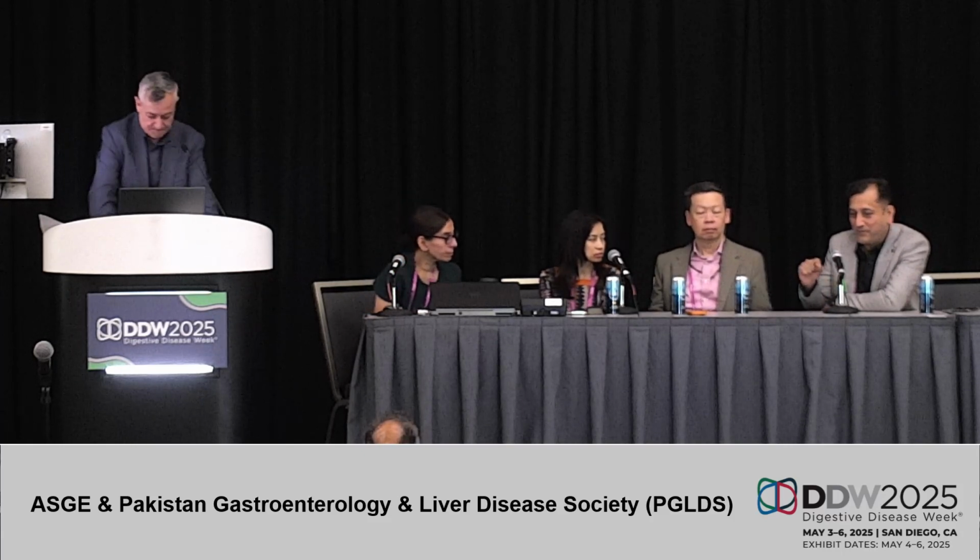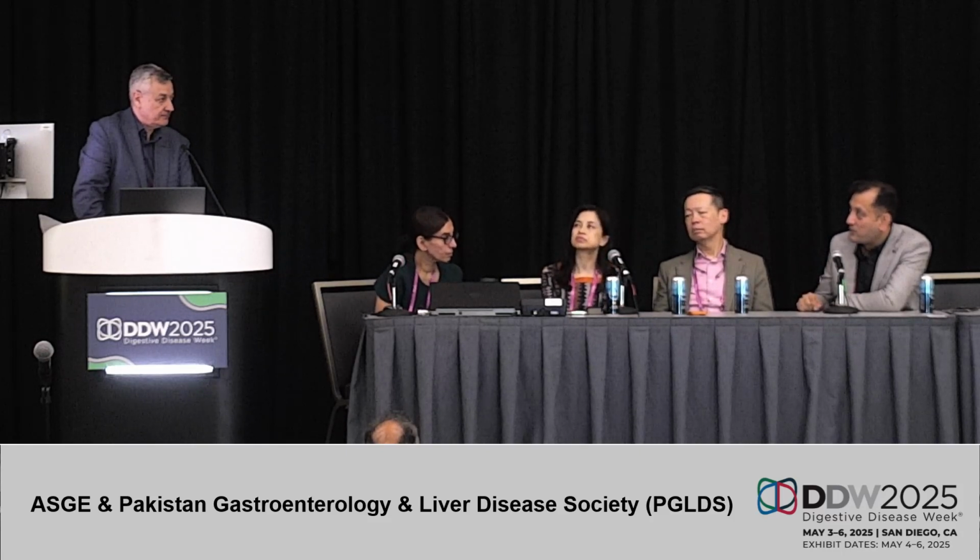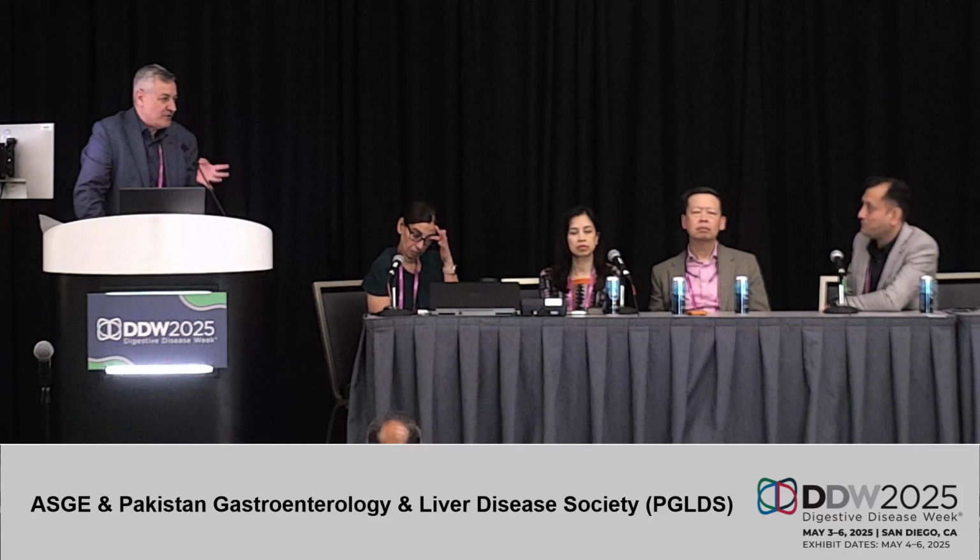What I personally do is usually target the area where the vessel is involved, maybe closer to the vascular invasion. Could that be helpful? Yeah. I think everybody does it in a different fashion. We usually do fanning for diagnosis, definitely, but of course we try to target areas.